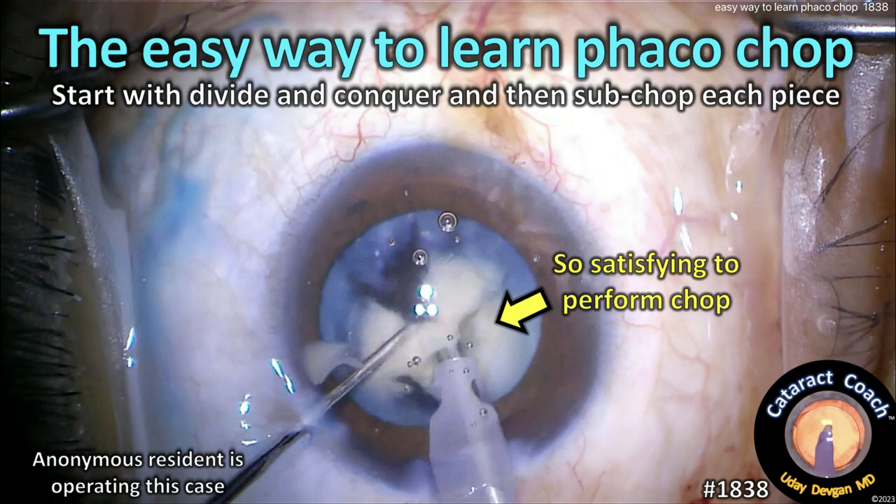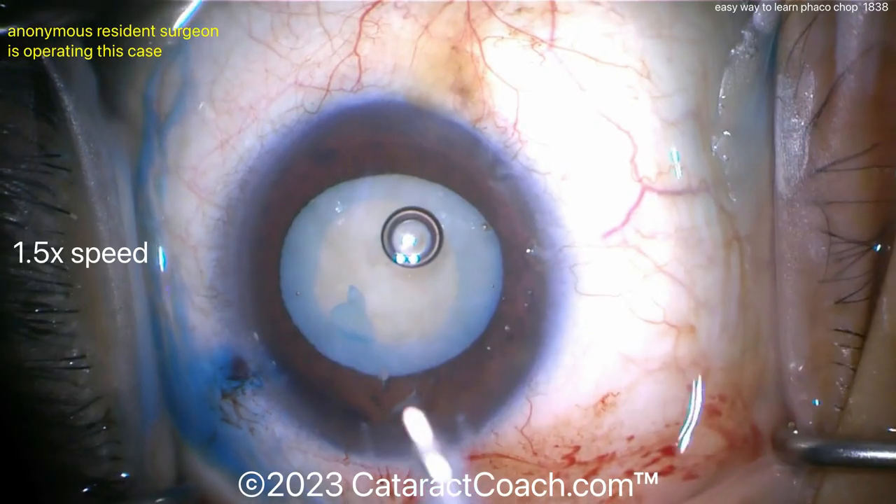CataractCoach.com — the easy way to learn phaco chop is to start with divide and conquer and then just sub-chop each little piece.